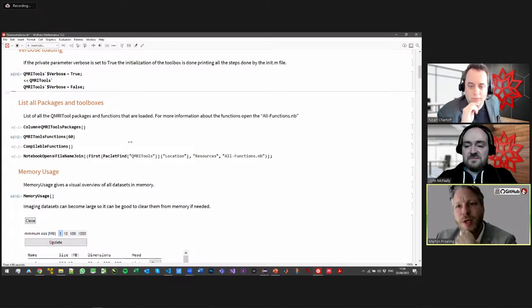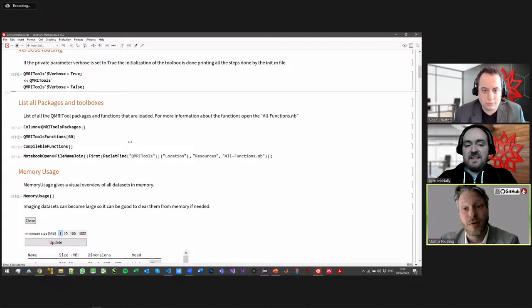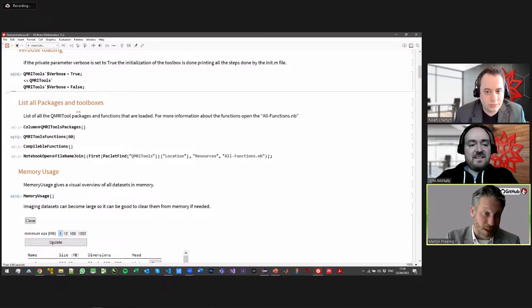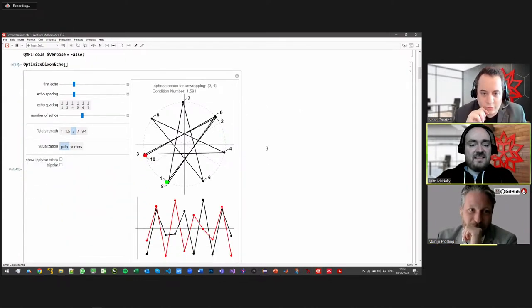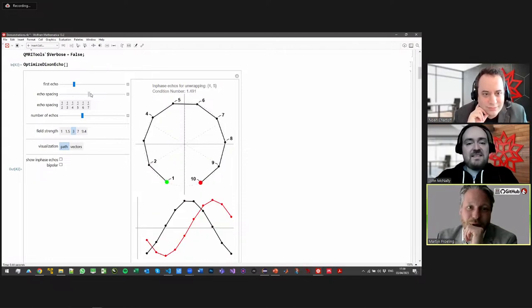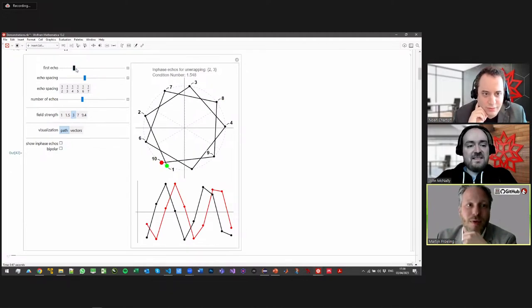With education, visualization is also really important. Sometimes you really need to visualize processes. And I think that has come a long way in generating movies and animations with Manipulate. It's quite easy to show stuff happening. For example, one of the things very specific to this Dixon technique is, I think, optimize Dixon Echo, this one. It's quite cryptic to show, but here we need to optimize two parameters and it does different things with the signal. So this can be quite helpful to show what's going on.